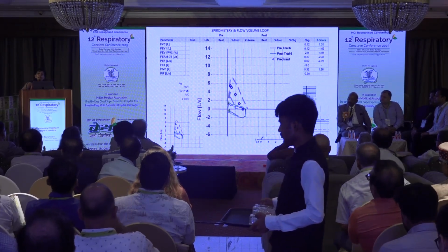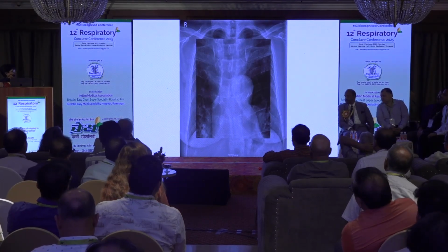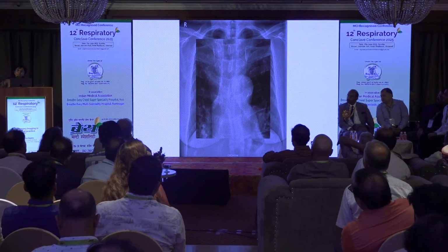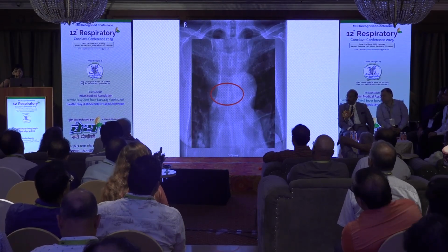And then in hindsight, or retrospectively, everyone becomes intelligent. So when the PG came to me, I said, go back and see the X-ray. And then we looked back at this X-ray again and we can see actually there is something endotracheal. See, retrospectively everybody becomes intelligent. So I also became intelligent by saying so.